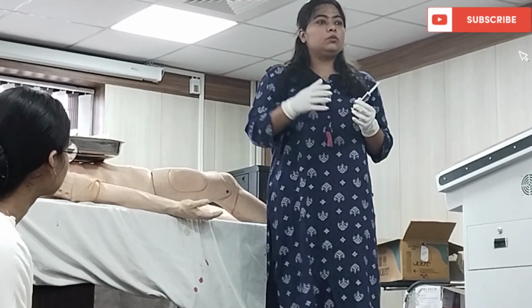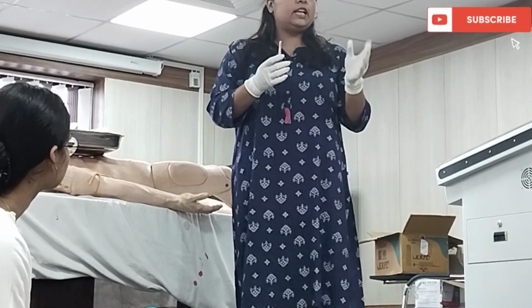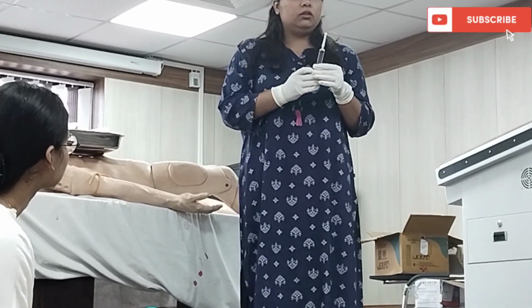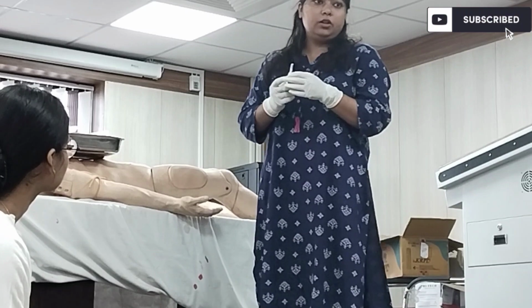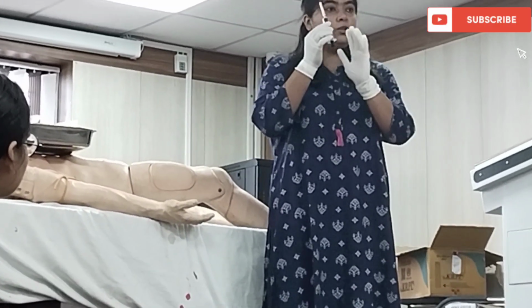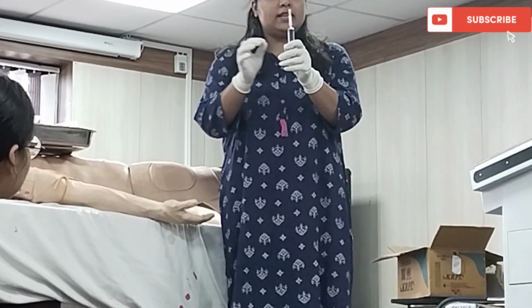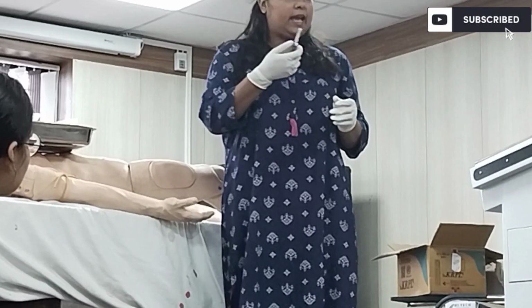Also, sometimes when a patient is admitted for a longer time, just explain that this much blood I am going to draw, and these are the tests that I am going to do. This is easy. After that, the syringe will also be provided to you in a sterile way. So your assistant or co-intern will open it and then you will take it.